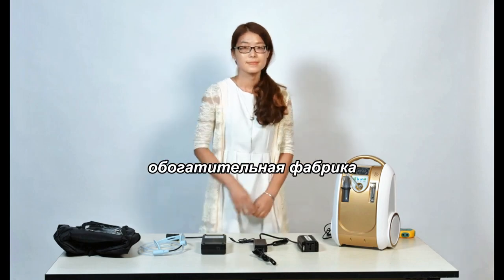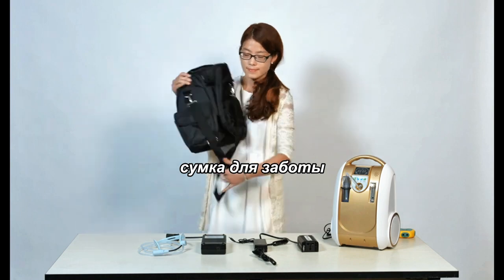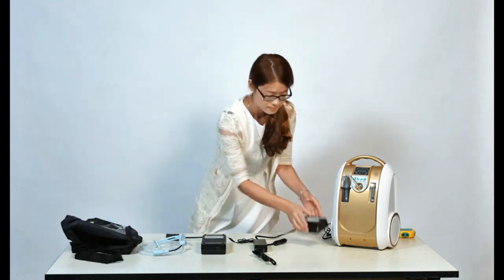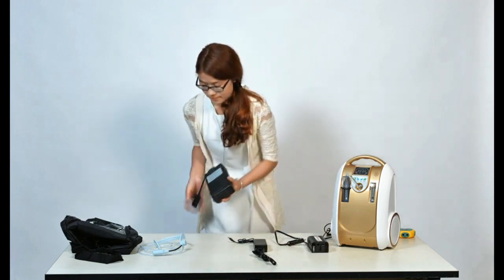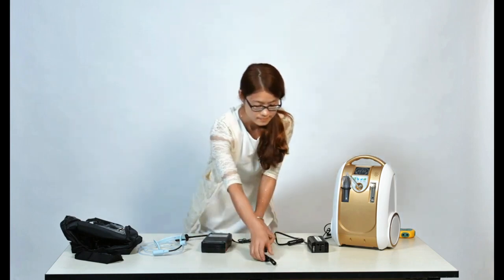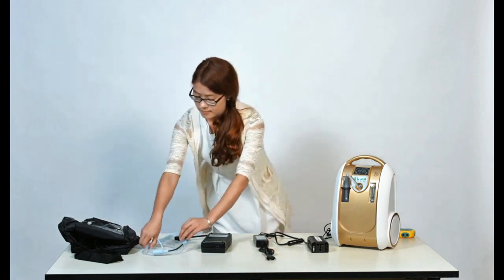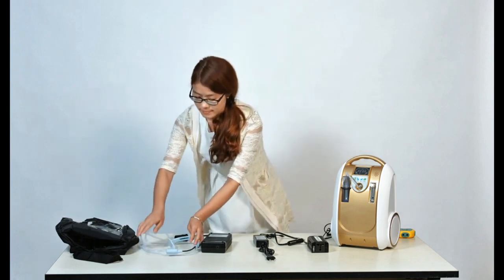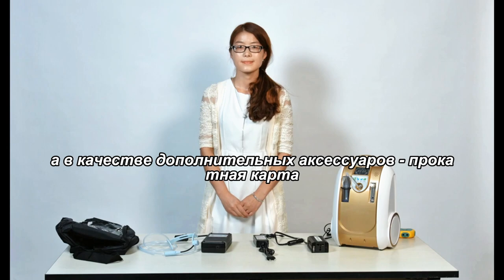The concentrator, a carrying bag, a car inverter, a battery, a battery recharger, a headset tube, and optional accessories include a rolling cart.